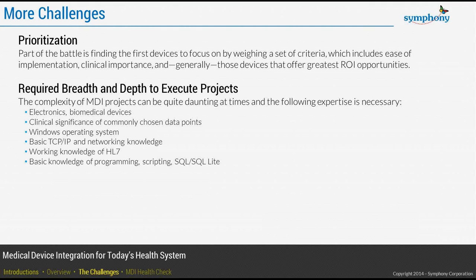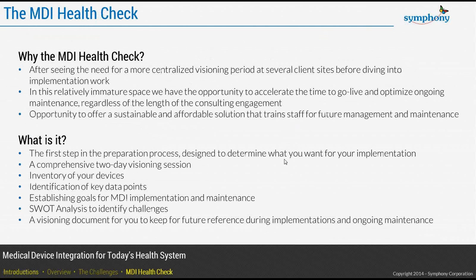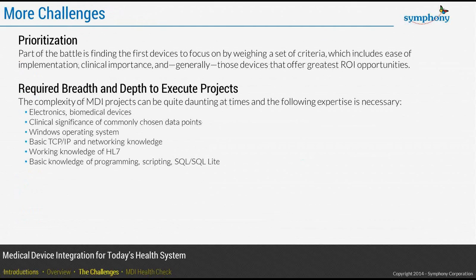HL7 is becoming more and more a kind of universal language for the transmission of this information. The more you know about HL7, the easier it is to look at a message and say, yes, that's right, or no, it isn't. And then a basic knowledge of programming, scripting, SQL.